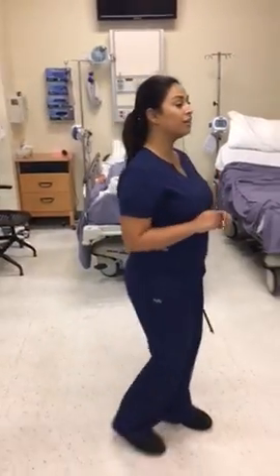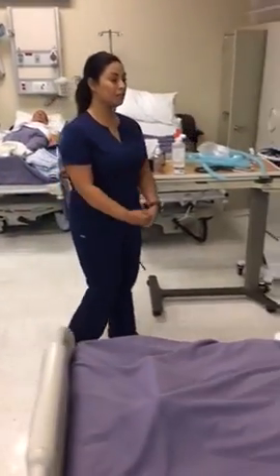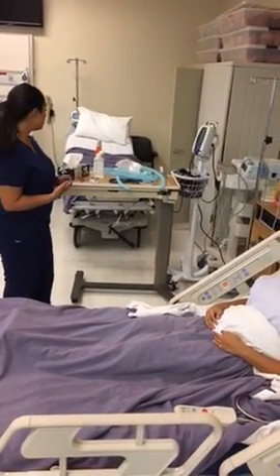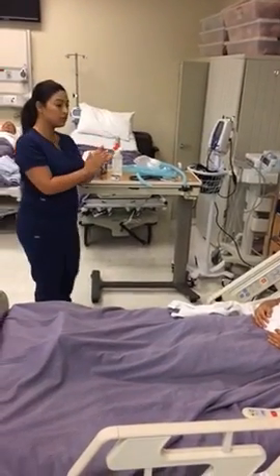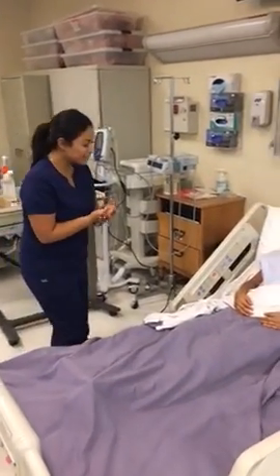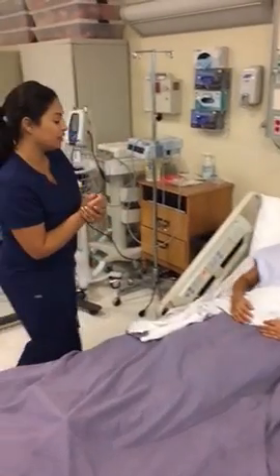Knock knock. Yes. Hi, Mrs. Islas. My name is Briana. I'm a student with the respiratory department. Before beginning, can I please get your first and last name, and your date of birth? Sure, it's Mickey Islas, 92782. Okay, thank you so much. And can I see your wristband, please? Sure. Okay, great. Thank you so much.